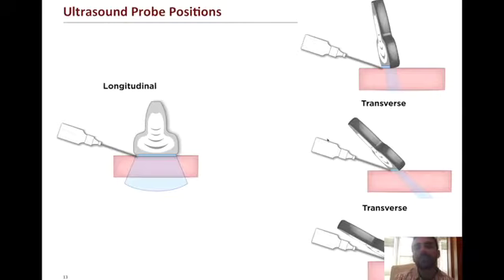So this is a cartoon indicating that fanning technique. As you proceed further in with your needle tip, you want to fan your ultrasound plane such that you're always in the needle's path. This is definitely one of those things that sounds intuitive, but it takes practice, and there has been publications of almost up to a 30% failure of detection of the needle tip, even with the use of ultrasound.